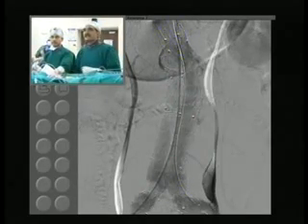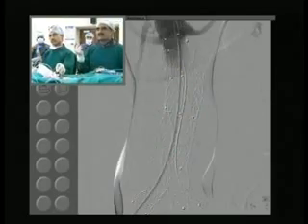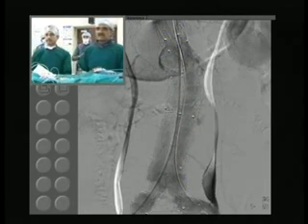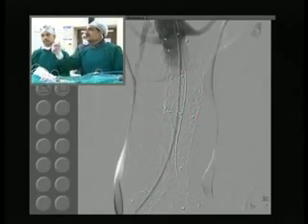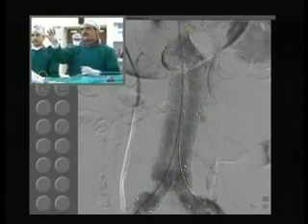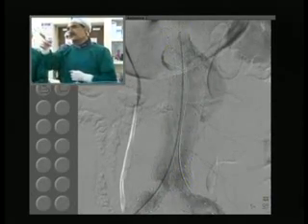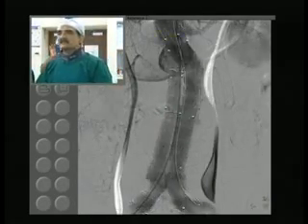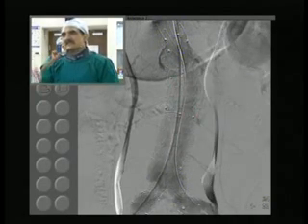That's okay. I think it is reduced from the previous one. It is very, very trivial now. Yeah, can you show that previous picture? So I feel this might settle on its own. Yeah, go back to the previous angio. So this is the previous one where there was a fairly distinct filling of the sac, but again very late. You can see that towards the end of the angiogram. Now show the last one. No, go back to this. Yeah, this is our last picture. It's probably very trivial. I feel that this is going to seal off on its own.